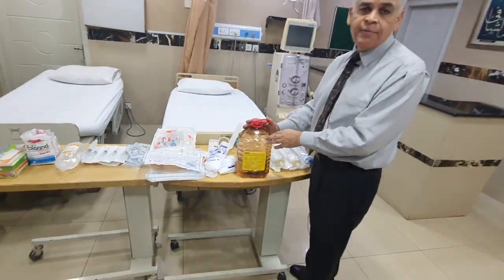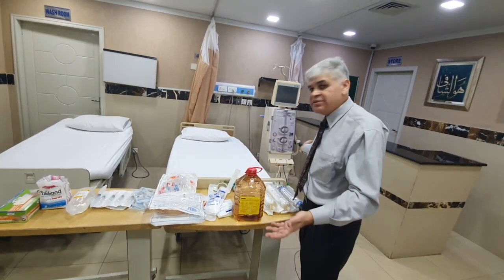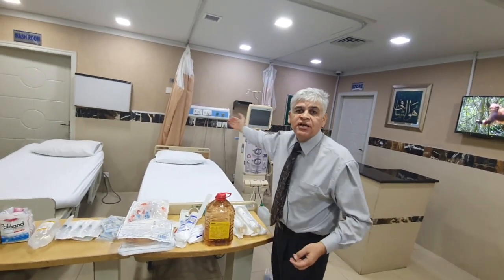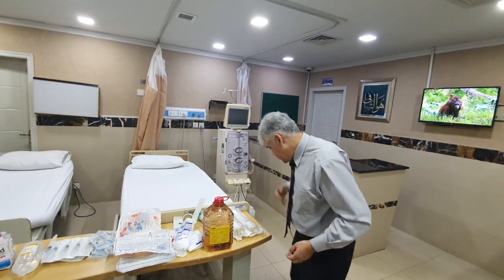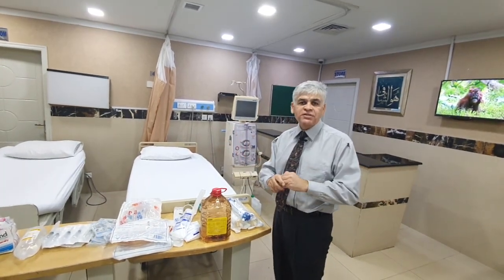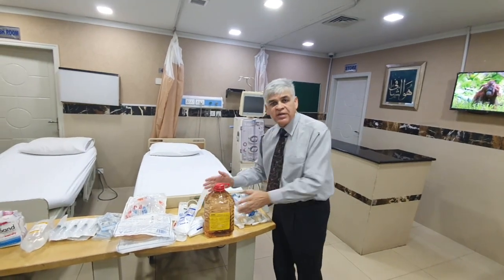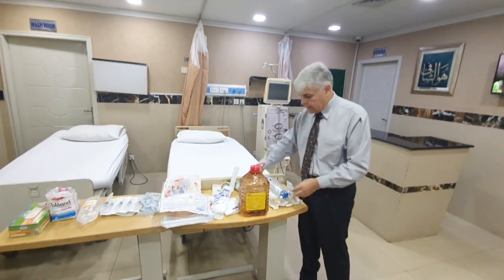In most of the dialysis units, we get a central delivery system in which the bicarb isn't available as such, but there is a bicarb which is made elsewhere, and then that is delivered inside the dialysis unit. So that's another thing. Either you've got a central delivery system, or if you don't have a central bicarb delivery system, no worries, you will have these ones, and you just have to make sure that you read the label, what the concentration is in here.